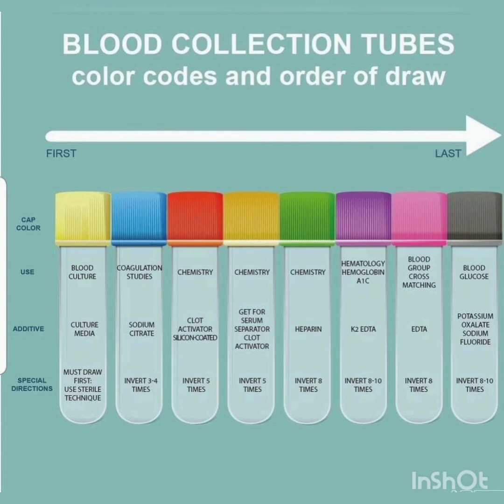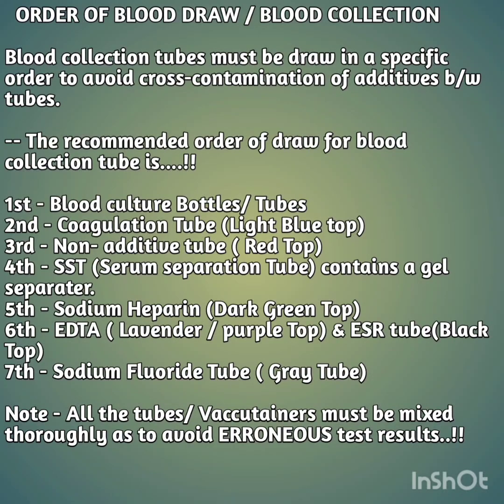So this is a small video on order of draw and the kinds of tubes and their additives. I hope you like it.